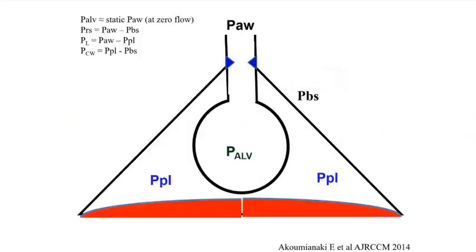And we had this figure, which is a schema of why we are interested in pleural pressure, and we'll see that we can replace pleural pressure by esophageal pressure. But the principle is that because the lung is in the chest, what pressure can be measured?